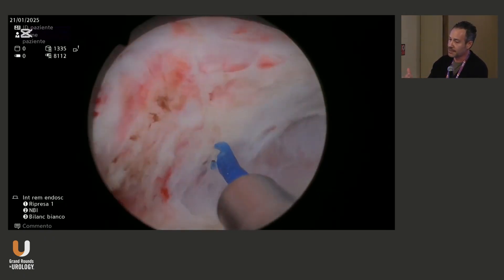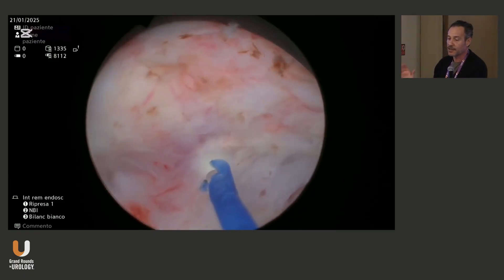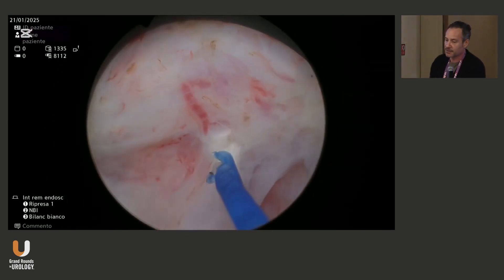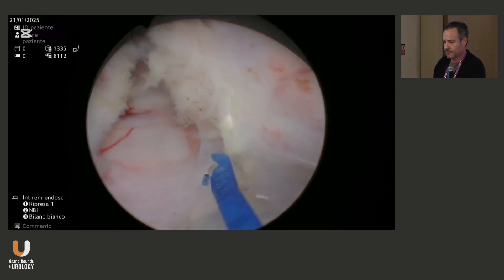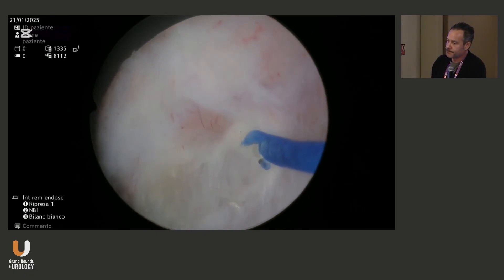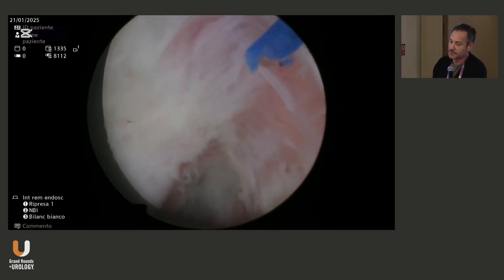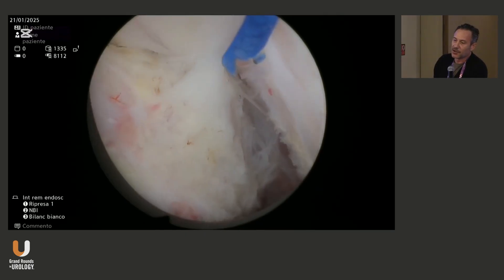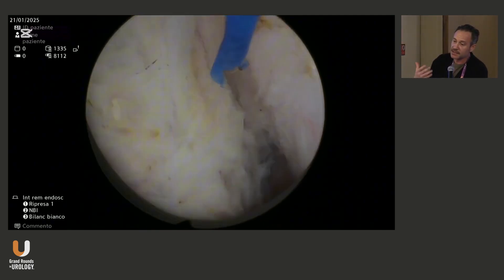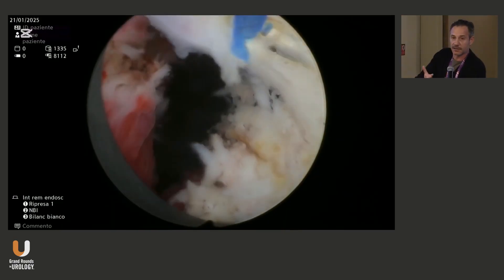If you have a large apex, this creates a different angle of the instrument stressing the sphincter. On this side we proceed as before — gently moving the prostate, creating tension, and then with coagulation just following the plane. On the left side we go counterclockwise like a pendulum from the base to the anterior part. Now we move on top of the gland, still using just coagulation, not forcing anything. You can increase power when you are around two o'clock, especially if you have a lot of tissue and adhesion. And this is the rendezvous at 12 o'clock — here you can go a little bit faster, increasing the power.